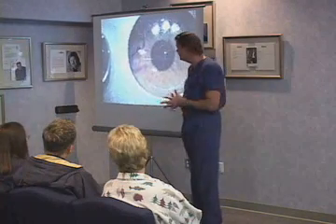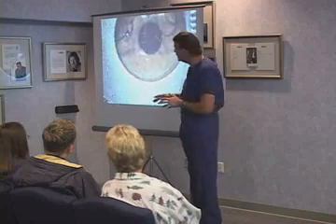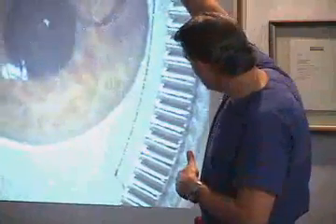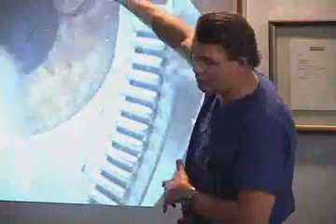This is an eye holder that's part of the keratome that actually does the flap. And we get it in position, and I kind of fussed with it a little bit because Kevin was a little bit frolicky. And I just wanted to get it exactly where I wanted it. Once it's there, we engage it. It holds the eye steady. And then the second half of the instrument, this is a German-made engineered instrument, will actually make a pass and swing up like this along this little track. It's all automated, and it will back off. And during that pass, we'll create the flap.